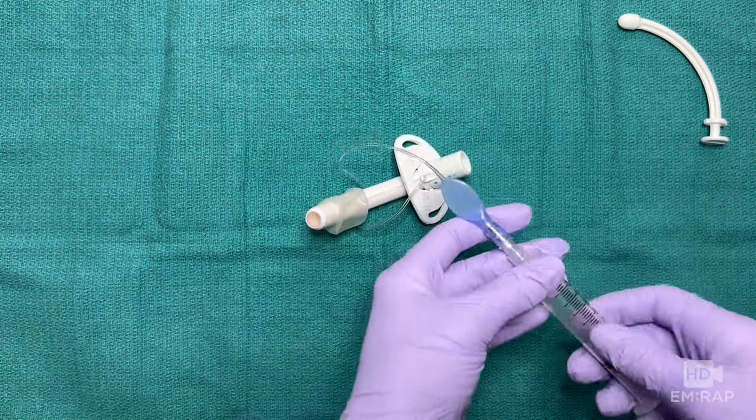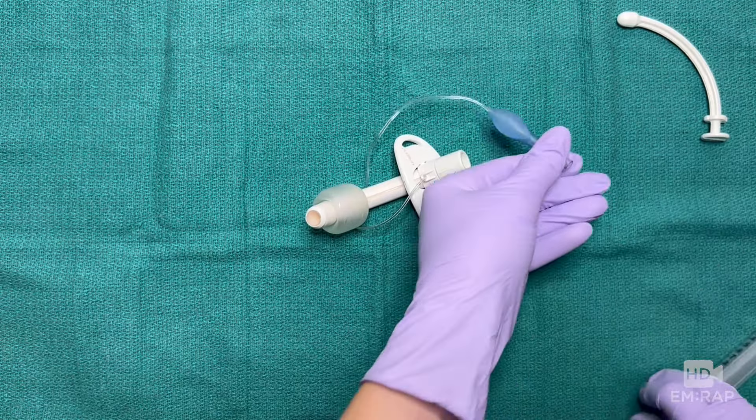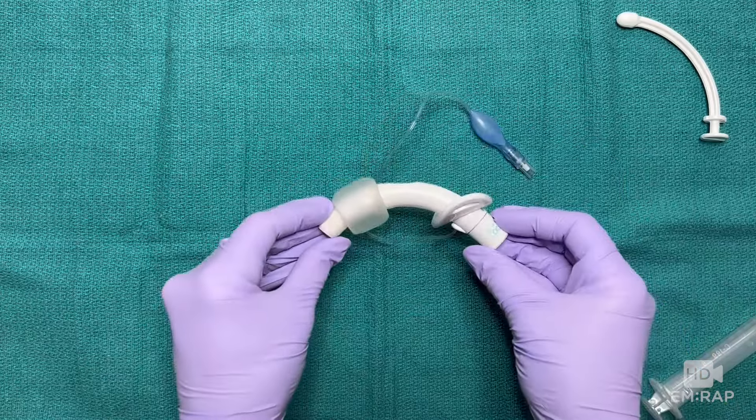When you inflate the cuff, the pilot balloon will also become inflated, so you know that it's working. At this point, the device would be secured in place with a tracheostomy collar.